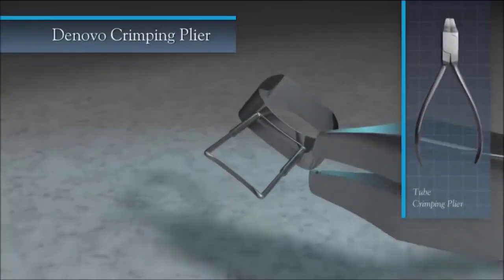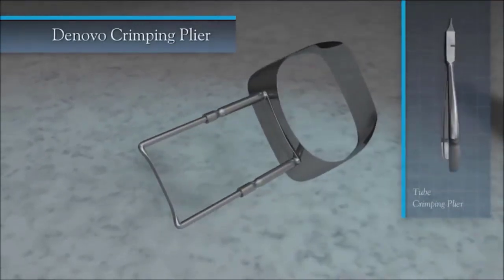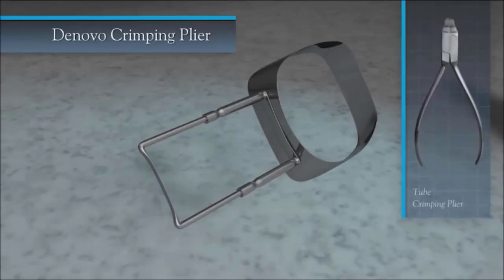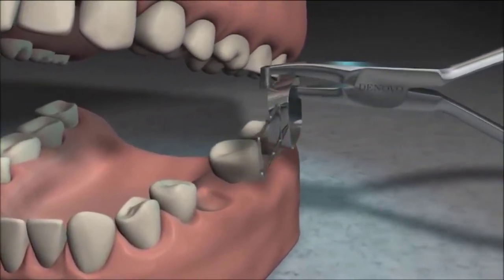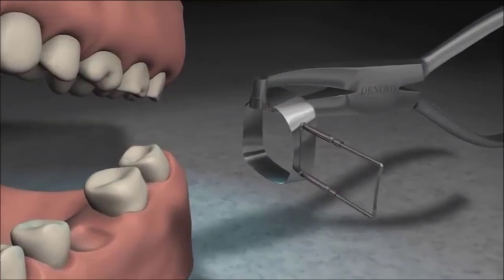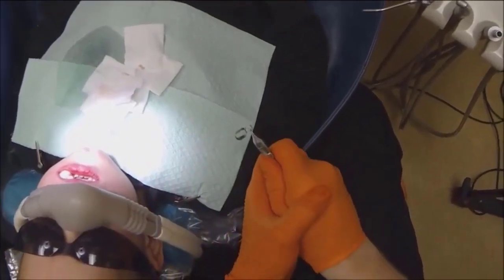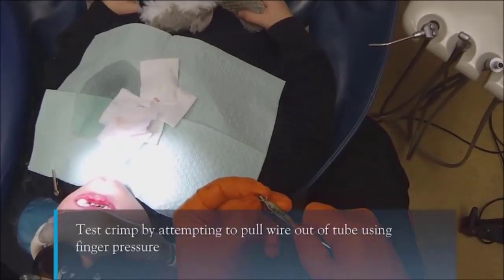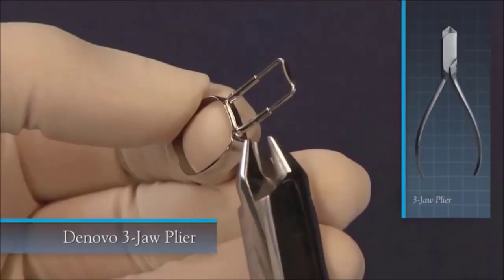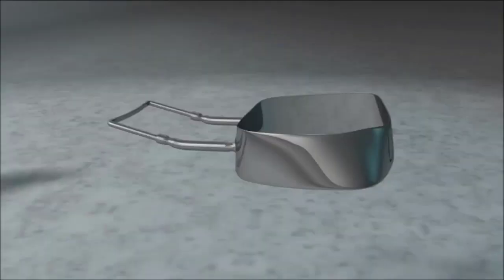If there is a gap, pull the wire outward until it is flush. Once contact is made, use the De Novo crimping plier to lightly crimp the wire to hold it in place. The crimping plier has a notch in the tip that encircles the tube, allowing you to crimp all the way around. Crimp the tube near where the wire enters it. Remove the band using the crimping pliers or band remover, then perform the final hard crimp on both tubes with a firm, strong squeeze. It is not possible to over-crimp using the crimping plier. Test the crimp by attempting to pull the wire out with finger pressure.